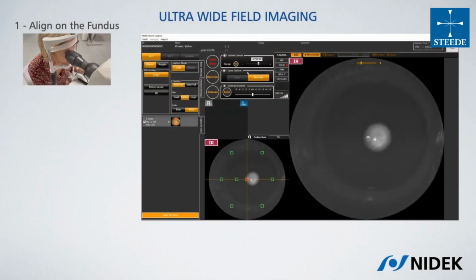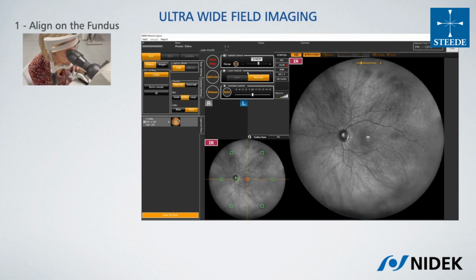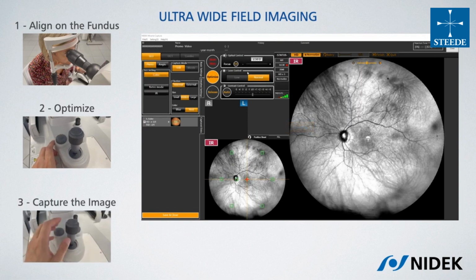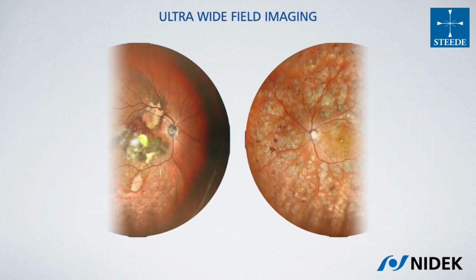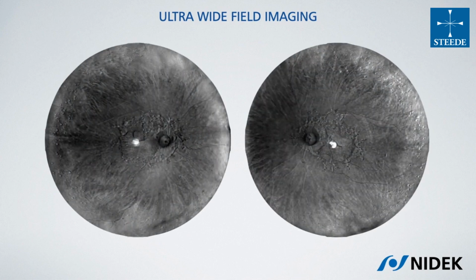As the attachable ultra-wide field lens is more protrudent, one trick to try avoiding touching the patient is to swing temporarily and tilt inferiorly the optical head. We can then proceed with the optimization of the fundus pictures and the capture of it. And in this very same way, we can also take ultra-wide field fluorescein and indocyanine angiographies, ultra-wide field color images, and ultra-wide field retromode images.